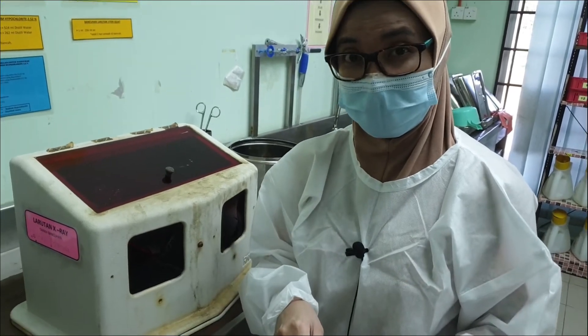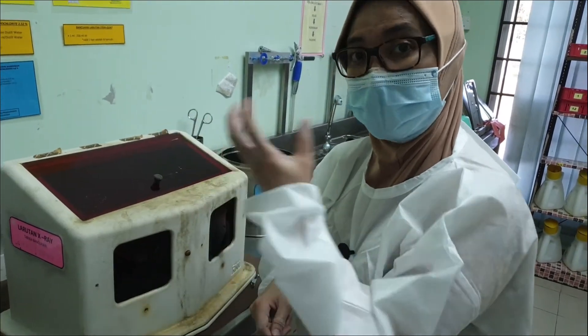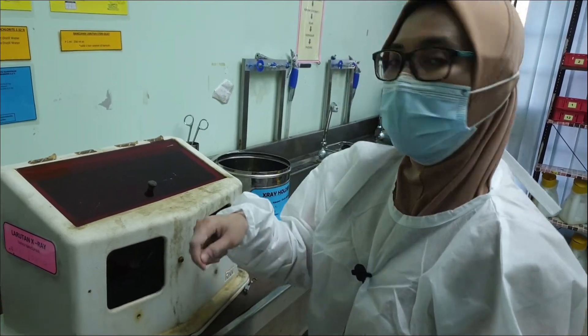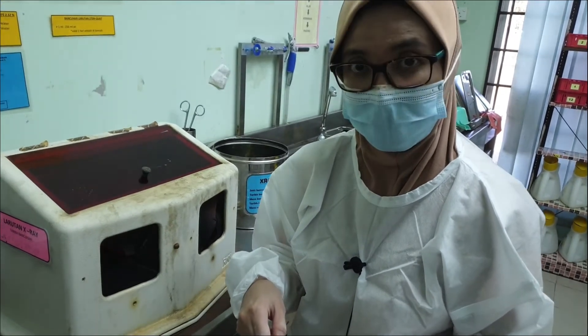So that's 30 seconds in the developer solution. Next, you will wash it in the plain water — the container next to the developer solution — again for 30 seconds.